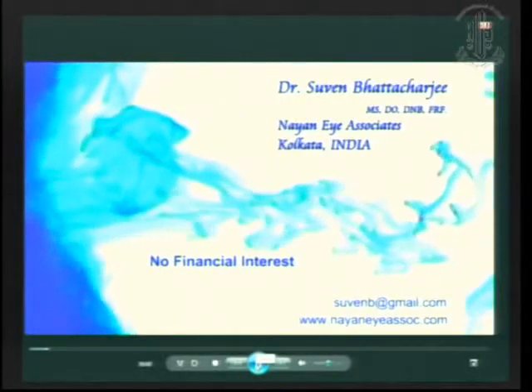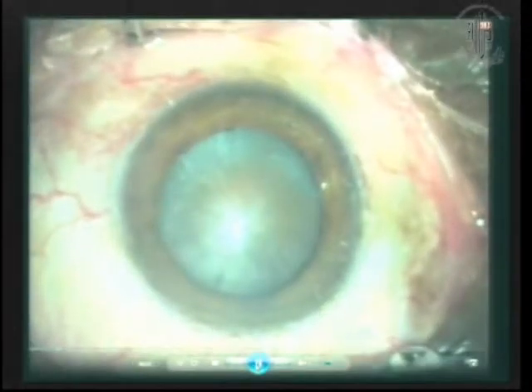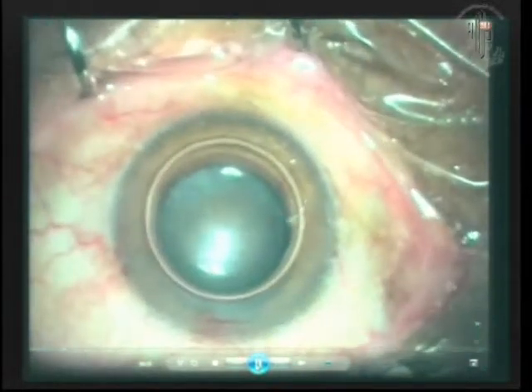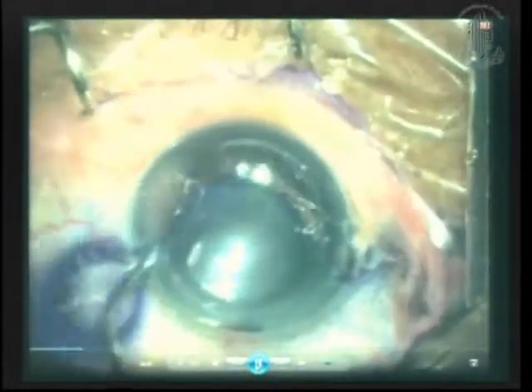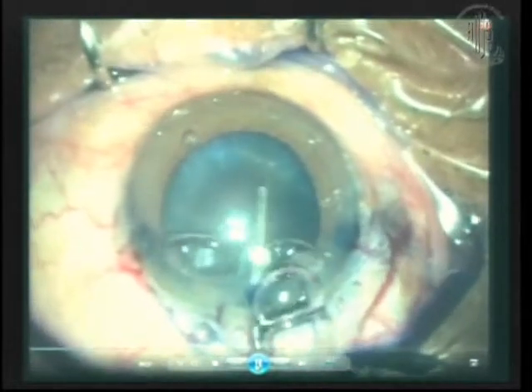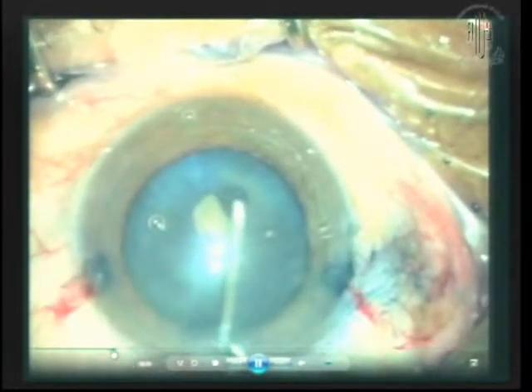Now, I've been doing that for many years now. I have no financial interest in complications. This is my standard technique: a hard, mature cataract, air injected, trypan blue goes in under the air, gentle, spreads very easily, uniformly all over the place. Very happy. I've been doing it for many years, never had a problem with this. The air is replaced with viscoelastic, and now let's see what happened. Then this is a lovely rexis which goes on. Nothing extra to show over here, but because of paucity of time, we'll just move ahead.